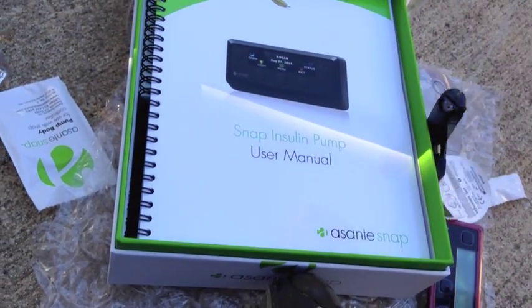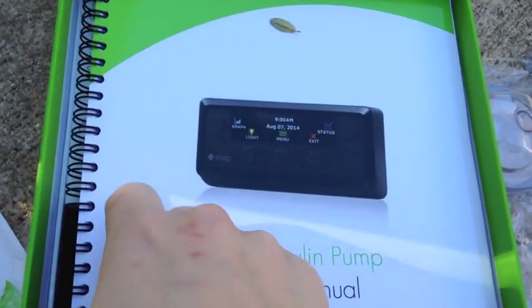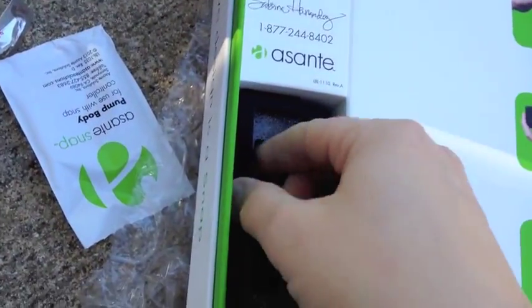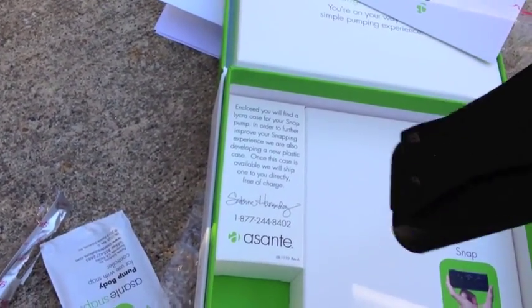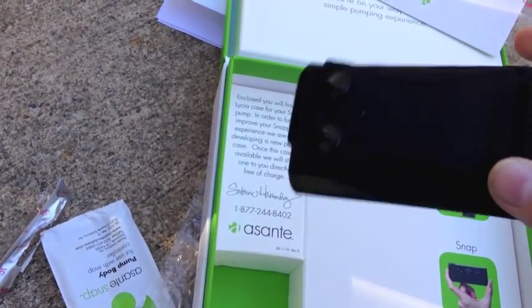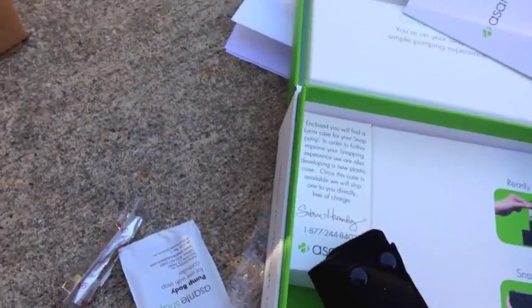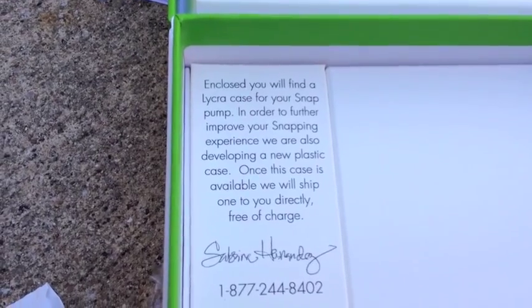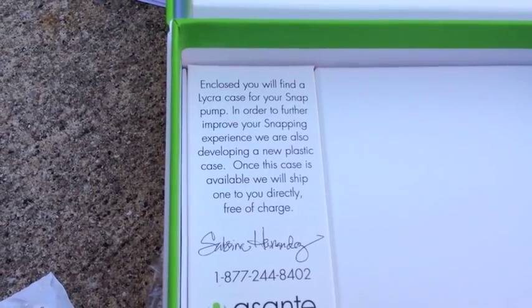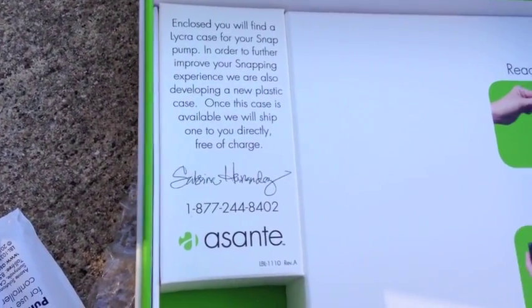Inside the box you get the user manual updated with the new MySnap Design, and a brand new Lycra case with snaps on the back and a clip. It also says enclosed you'll find a Lycra case for your snap pump. In order to further improve your snapping experience we're also developing a new plastic case — once this case is available we will ship one to you directly free of charge.